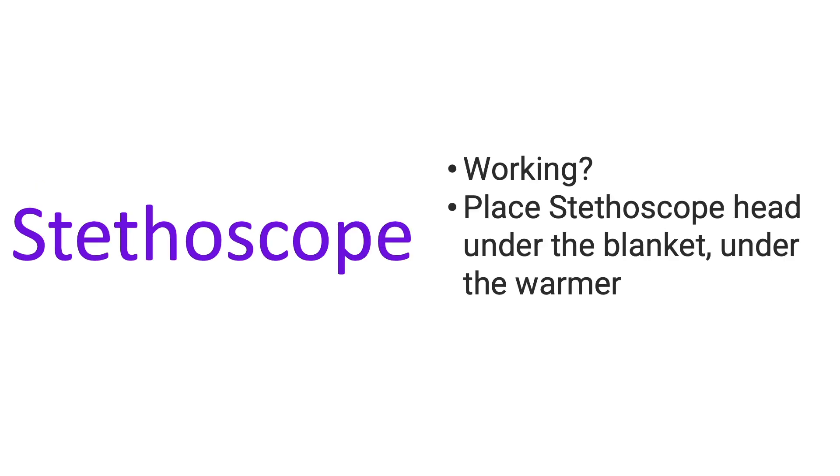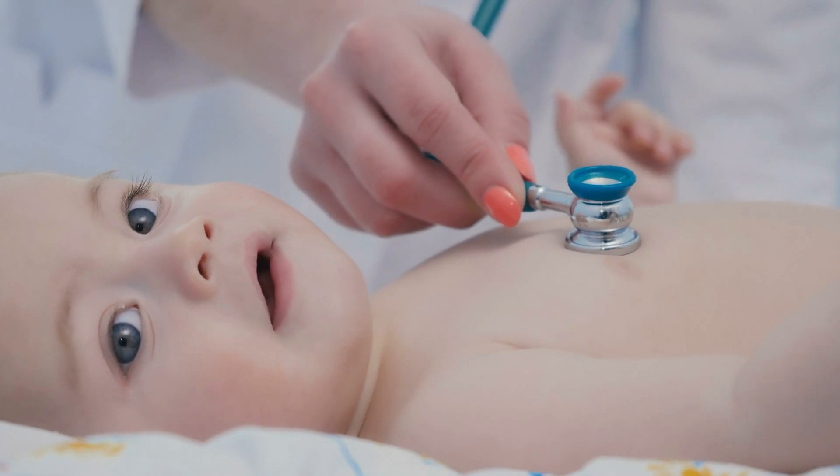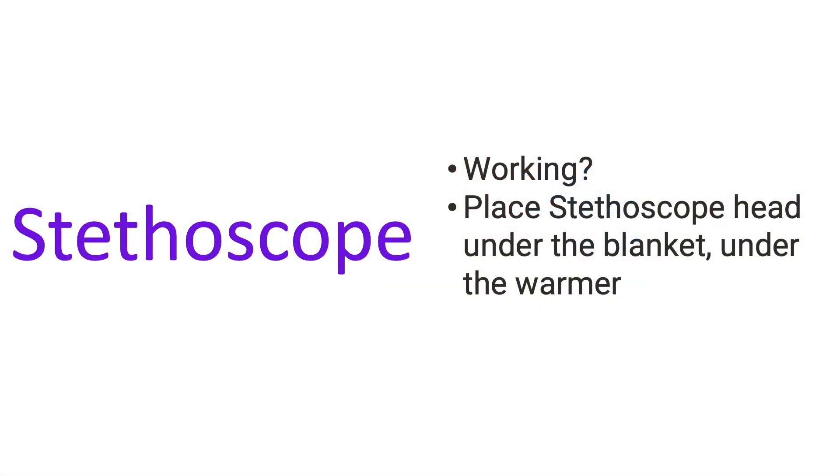Have your stethoscope ready, make sure it's functioning, and then place your stethoscope head under the blanket, under the warmer, so that it's nice and comfortable for the little baby.